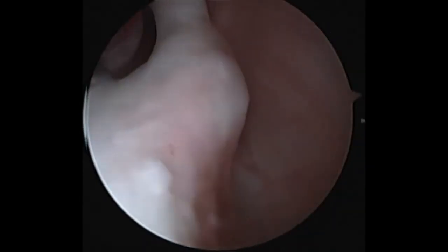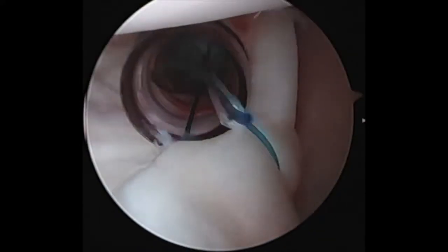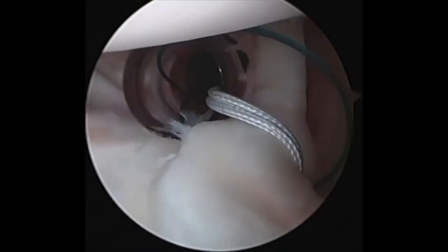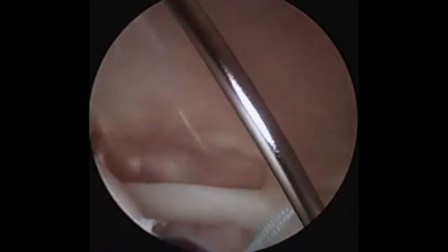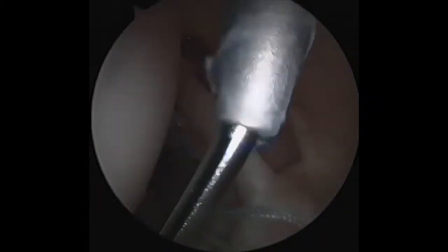Use the Reel Pass again and pass a suture around the superior labrum posterior to the biceps for the SLAP repair. Shuttle the number 2 FiberWire. Then I use the Percutaneous kit from Arthrex. I use a long spinal needle in the kit, and then a dilator, and then the Percutaneous cannula.